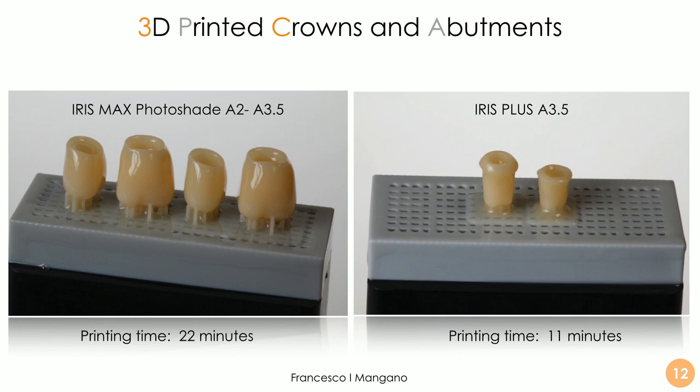We printed in two separate sessions. In the first session we used Iris Max photo shade A2-A3.5 for the crowns. In a second separate session we printed the individual abutment with Iris Plus A3.5. The technology is super powerful — we can obtain the crowns in a very short time frame: 22 minutes overall for 4 crowns. We can also print up to 5 crowns in this machine, and only 11 minutes for the individual hybrid abutment.